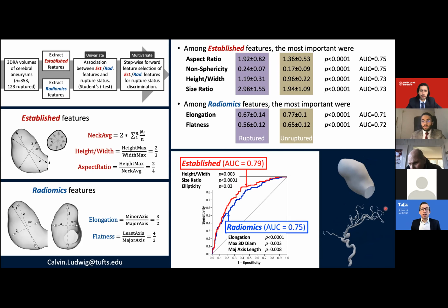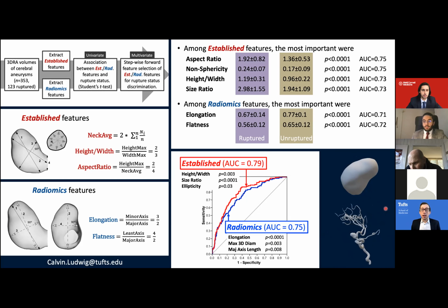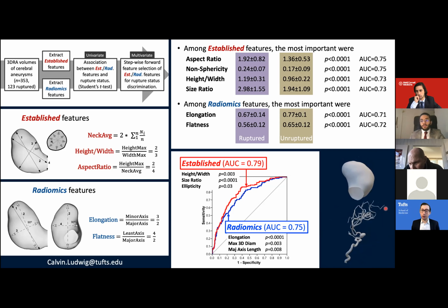Absolutely. I think as imaging modalities get more and more detailed and can assess the thickness of the wall of the aneurysm, as you might know, when we inject contrast, we lose a bit of that because the contrast glows up really quite bright, and you lose a bit of the exact dynamics of the wall of the aneurysm. But the thickness or the undulation of the aneurysm could be applicable here, especially because radiomics has been applied in that realm for the liver cirrhosis patients.